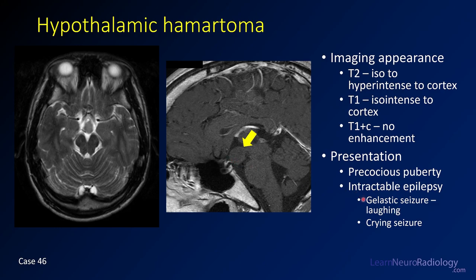The history you'll often see is a gelastic or laughing seizure, but that's not the most common presentation. The most common presentation is precocious puberty or early puberty. Patients can also get other seizures in this location. If you see a non-enhancing mass in this location, think hypothalamic hamartoma. Germinomas and craniopharyngiomas tend to be more heterogeneous and have more enhancement.